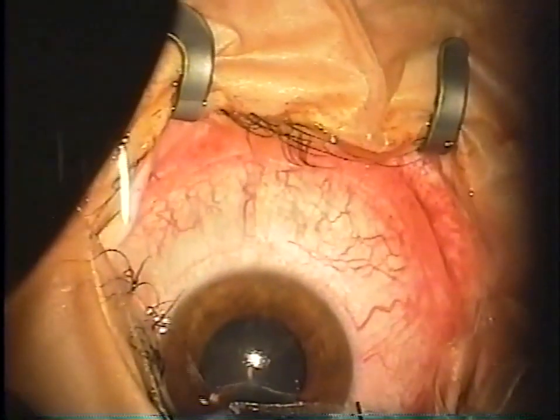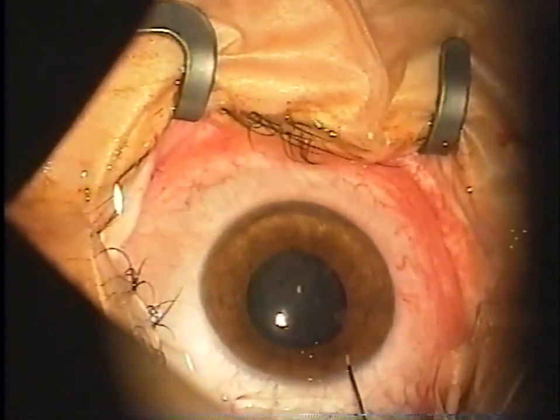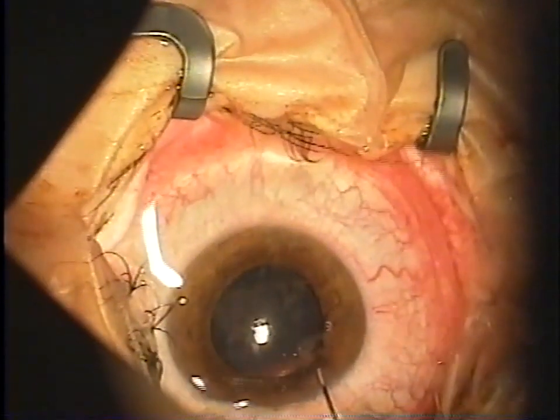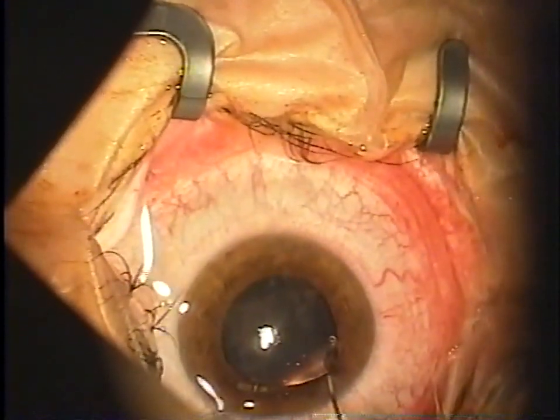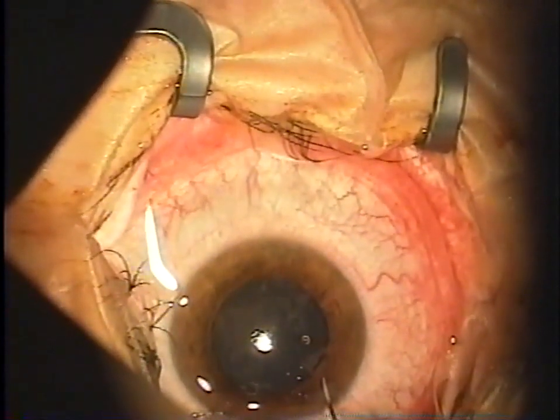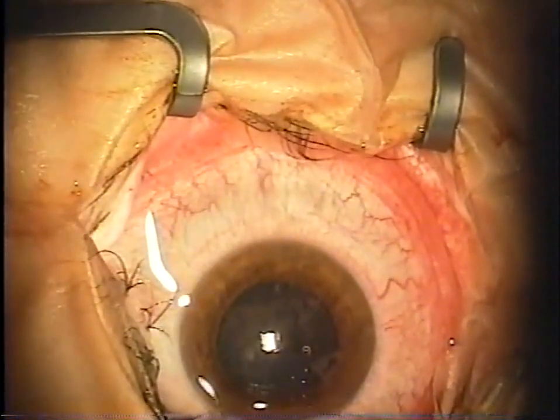Next, some preservative-free and sulfite-free lidocaine is instilled in the anterior chamber. If you are a cataract surgeon also, like myself, you want to avoid putting any kind of epinephrine or phenylephrine in the eye, as later on you're going to need to constrict the pupil, and that causes some problems later on in the procedure.